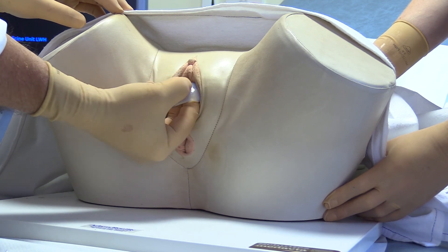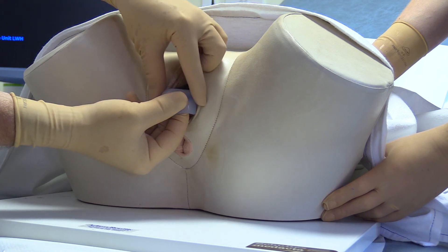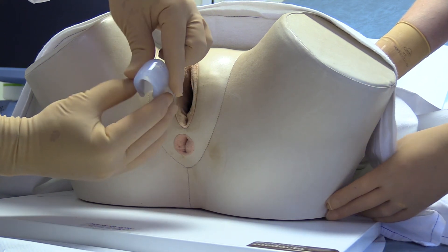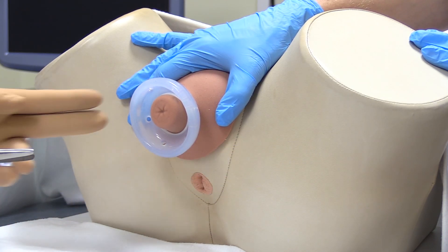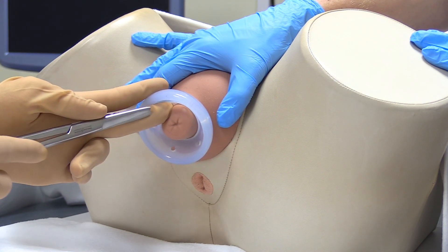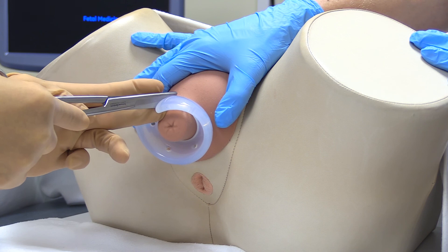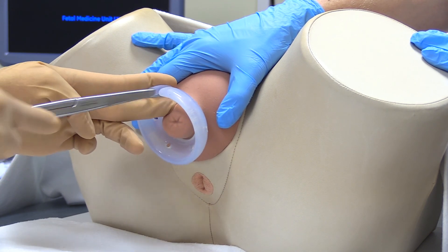When removing the pessary from the introitus, it is useful to compress the pessary with the non-dominant hand until it is completely removed. For a very few women, the cervical tissue becomes so edematous in the pessary that it makes removal very difficult. In this situation, the pessary can be cut along one side using episiotomy scissors. Use one hand to guide the tip of the scissors and protect the tissue.